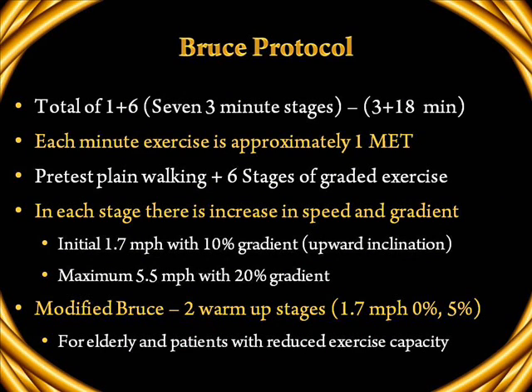Exercise testing can be done using several different types of protocols. The most widely used protocol is the Bruce protocol. This has one resting stage and six stages of exercise. Each stage of exercise has 3 minutes, totaling 18 minutes of exercise and 3 minutes of pre-exercise resting state. Each minute of exercise approximately corresponds to 1 MET of activity. Pre-test plain walking is the first or the zero stage, followed by 6 stages of graded exercise.